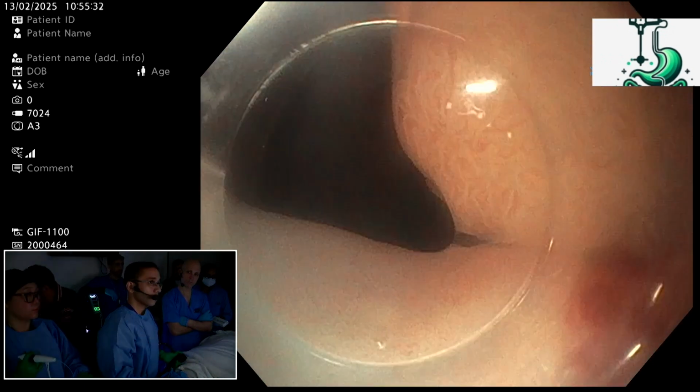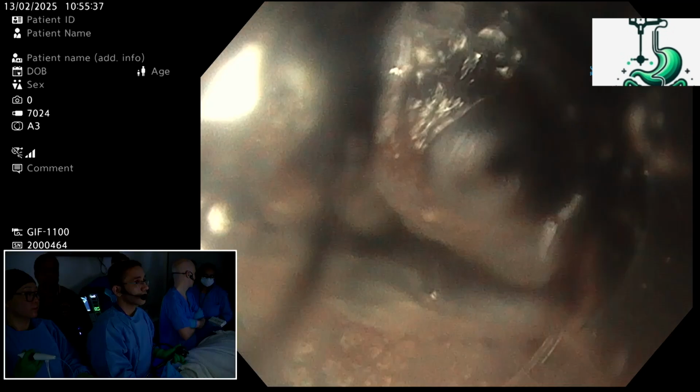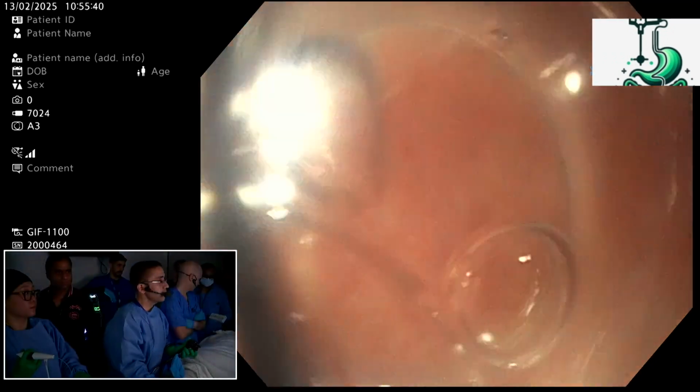Hello, Dr. Ahmed. Yes. Thank you for this nice case. I have a question. Which cap are you using? We will say everything, okay?